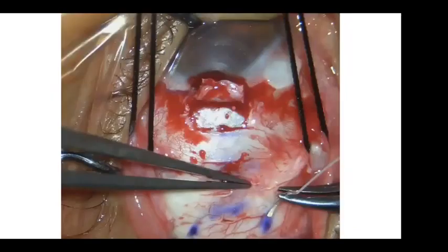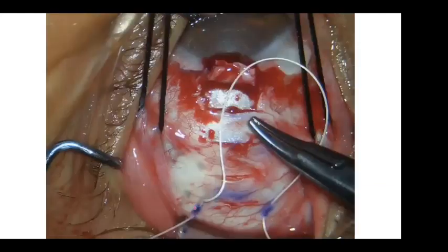So now, before I proceed forward, I put the sutures of the implant. It's like pre-placed sutures. Sometimes we put the implant and then go for the scleral sutures of the implant. But I'm working posterior, like 12 millimeters, which is not easy. It needs a bit of training for me and for the assisting scrub nurse as well. So nowadays I place the sutures before I proceed, and then I put the other suture, and then there is a loop which I cut, and then we have two sutures. I do that before putting the implant. This facilitated things for me.